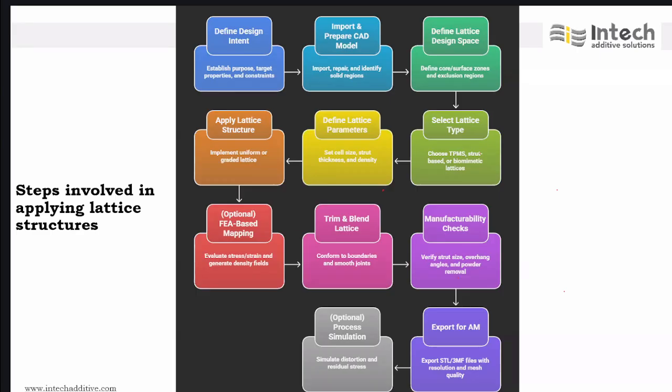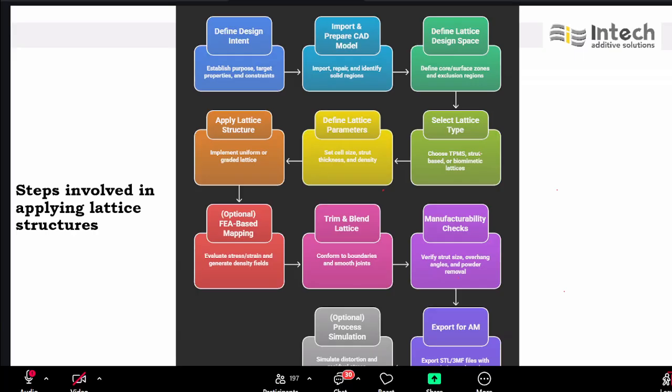You can even integrate with a library for topology optimization. Once the part is optimized using topology optimization, you can subject it to latticing, so that it helps to reduce weight further, and so on.